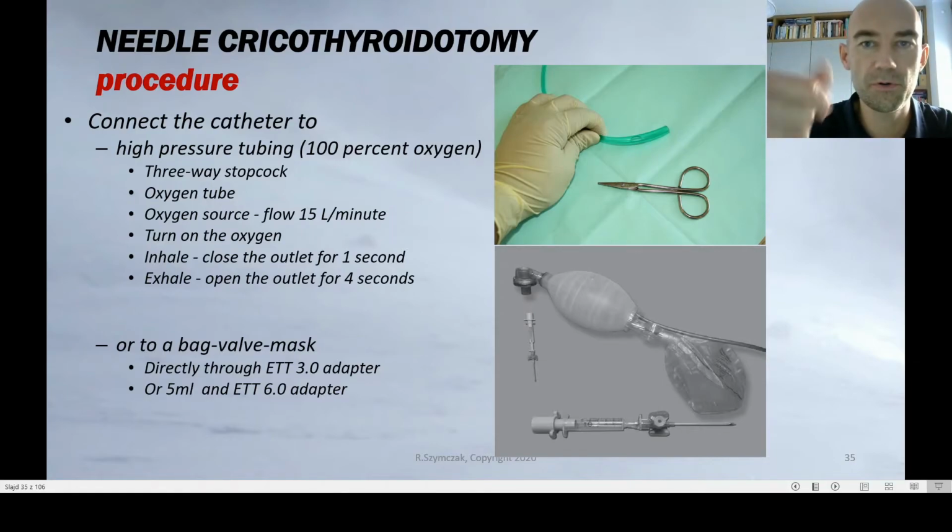So just push 1, 2, 3, 4, 5. So for 1 second is inhalation, for 4 seconds is exhalation.